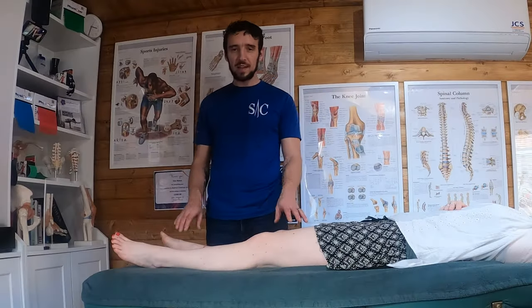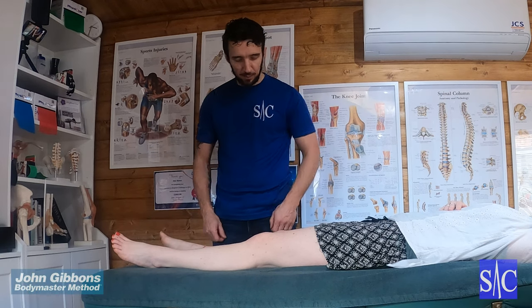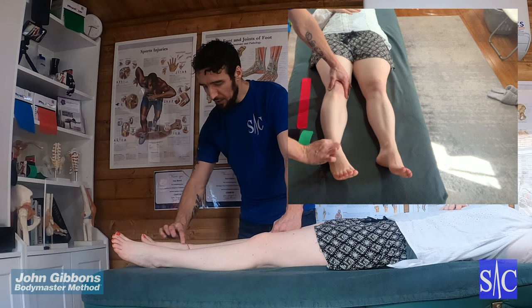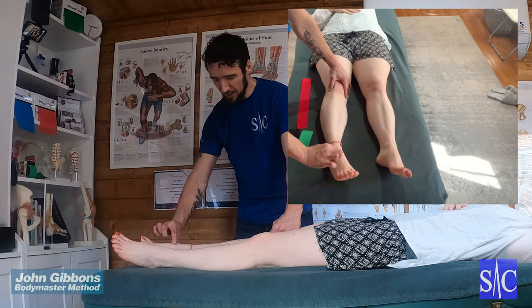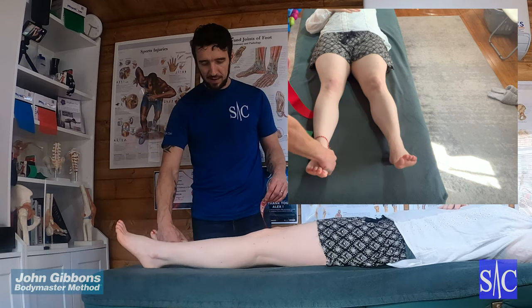This is a taping technique for tibialis anterior tendinopathy, anterior compartment syndrome, or basically any pain along the front of your shin. We're going to use three pieces of tape.